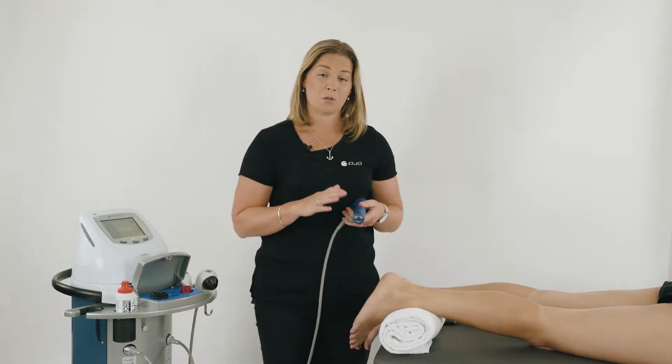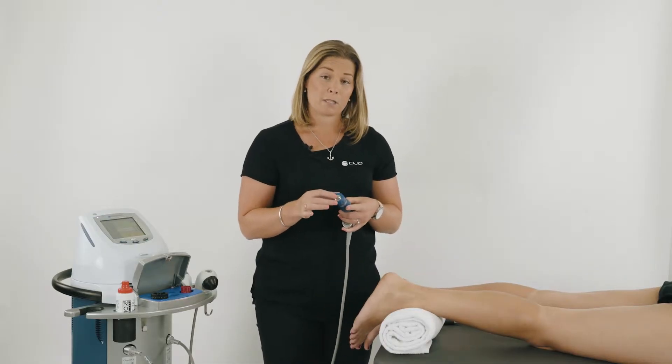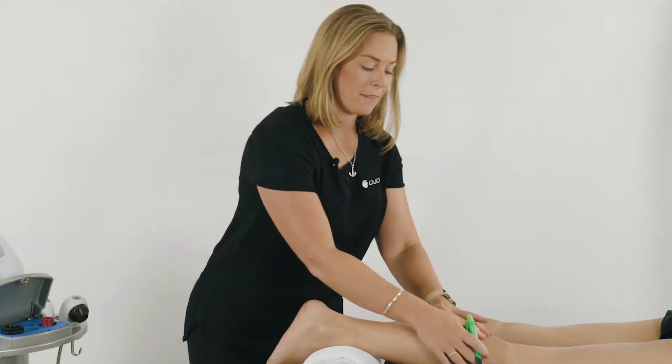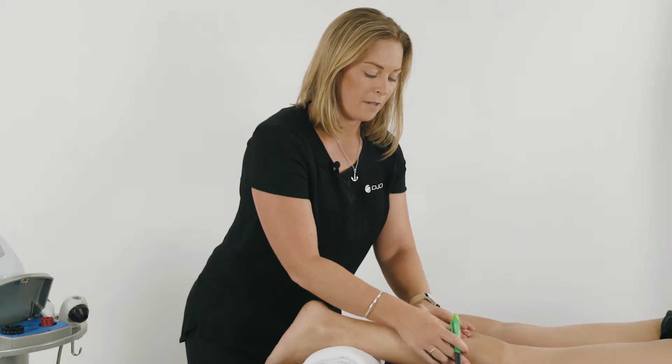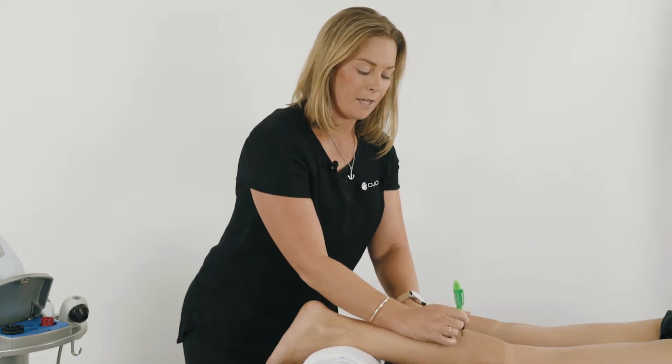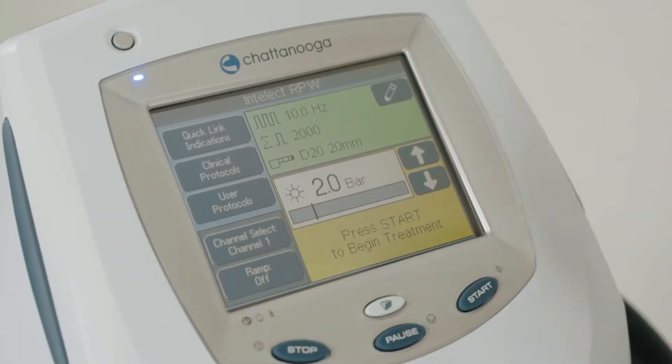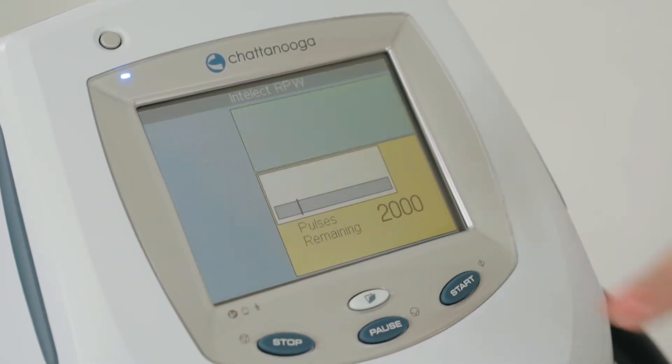The next step is to use the radial shockwave, using the D20 transmitter to address the trigger points in the calf muscle. Simply palpate the calf and locate any trigger points that cause the patient discomfort. From here we're going to select channel 1, back to your radial.